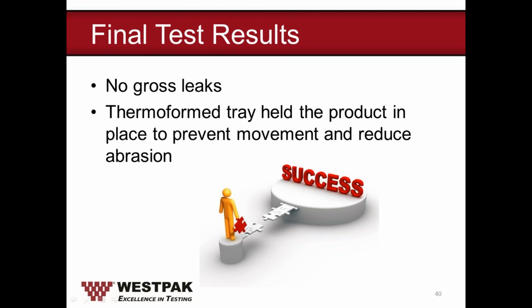So we repeat testing. We did the conditioning, the transit, and bubble testing. So this time there's no gross leak. The thermoform tray held the product in place to prevent movement and reduce the abrasion interaction.